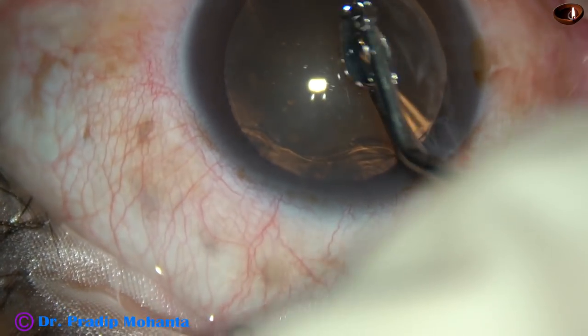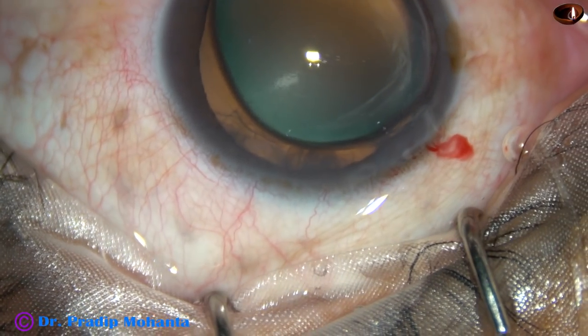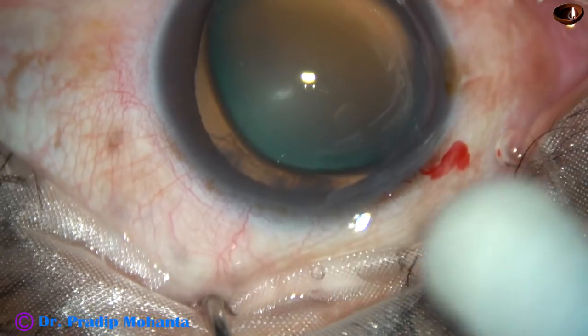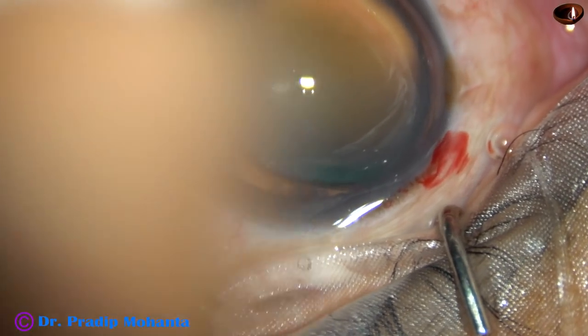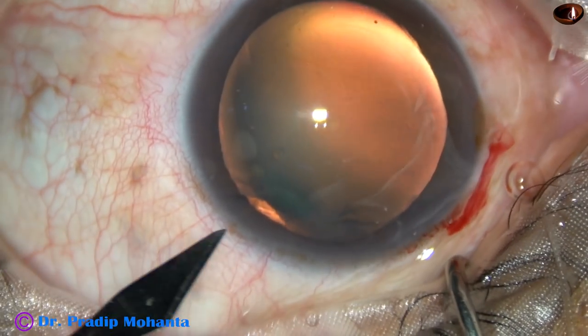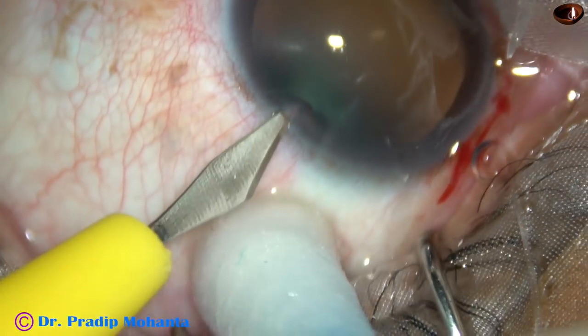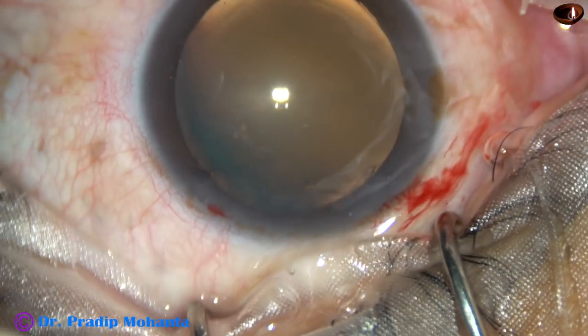By this time, the main incision has been made. 2% HPMC has been injected into the anterior chamber and has been sprayed over the corneal epithelium. This is a paracentesis on the left side of the main incision. Here it is.